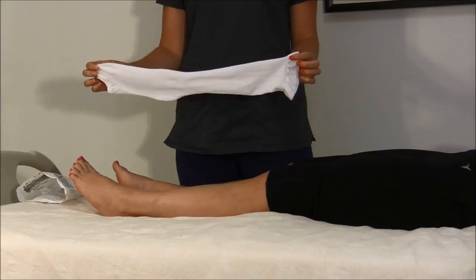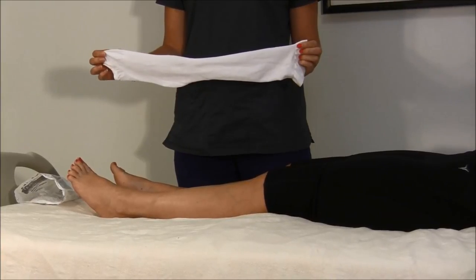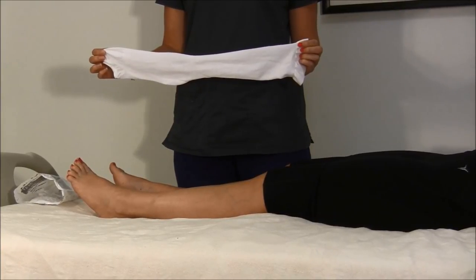Compression stockings are long, tight-fitting stockings that are worn after surgery to place pressure on the legs to help prevent the blood from clotting.